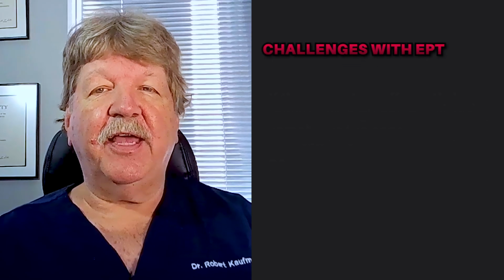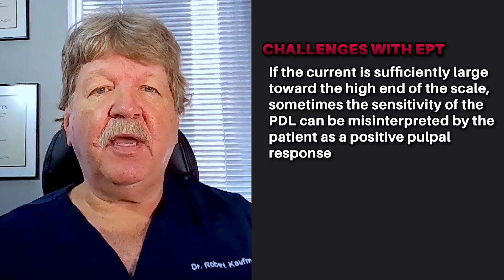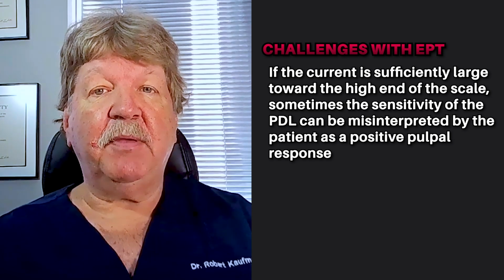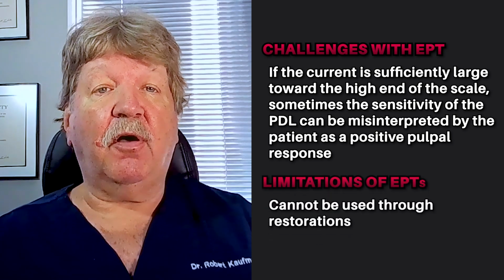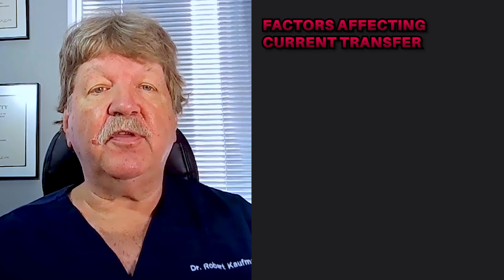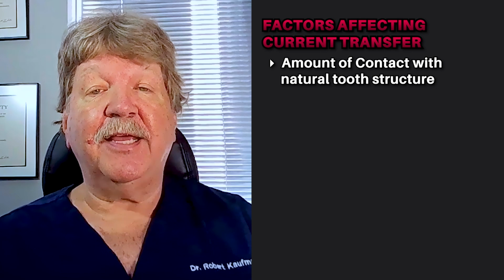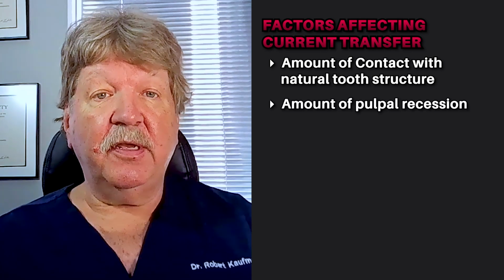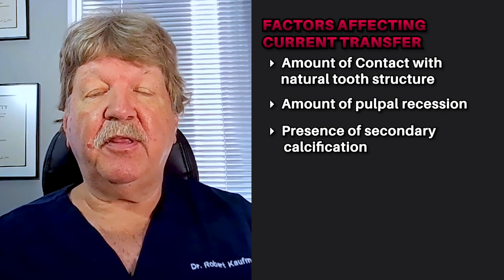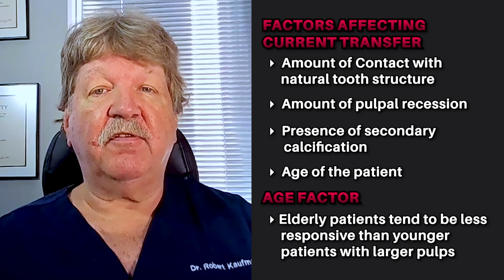Difficulty with this device is that if the current is sufficiently large and is toward the high end of the scale, sometimes the sensitivity of the PDL can be misinterpreted by the patient as a positive pulpal response. Electric pulp tests also cannot be used through restorations. The ability to transfer sufficient current to the tooth to get a response also depends upon several factors that include the amount of contact that the actual device has with the natural tooth structure, the amount of pulpal recession, the secondary calcification, and frequently the age of the patient. Elderly patients tend to be less responsive than younger patients with larger pulps.